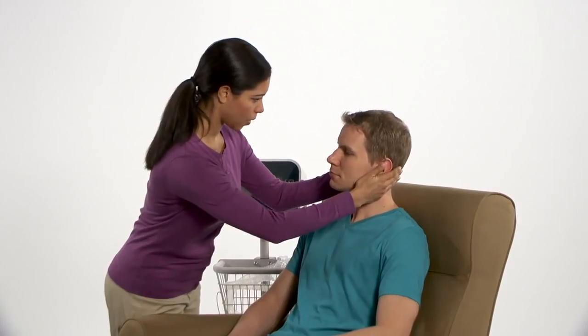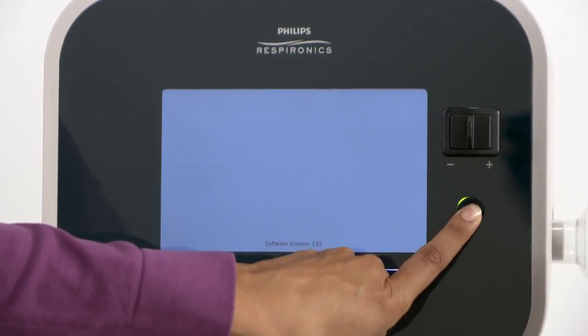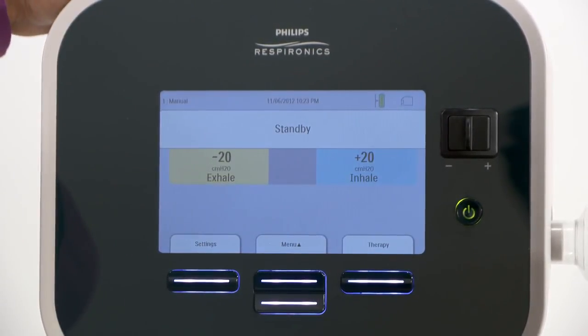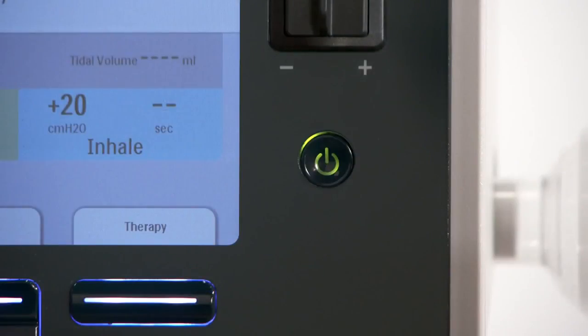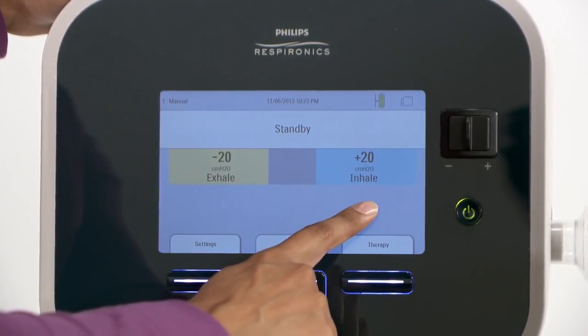Help the patient into as upright a position as he can tolerate. Press the round Start-Stop button on the front of the CoughAssist T70 to enter standby. If the device is running on AC power, the button will illuminate. Check the treatment settings to make sure they match the doctor's prescription.